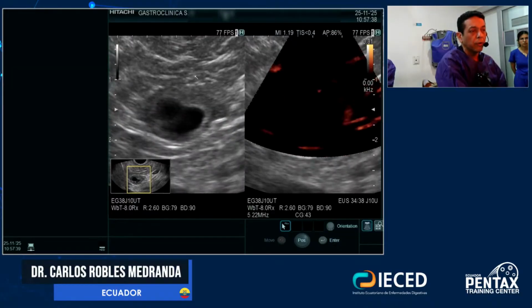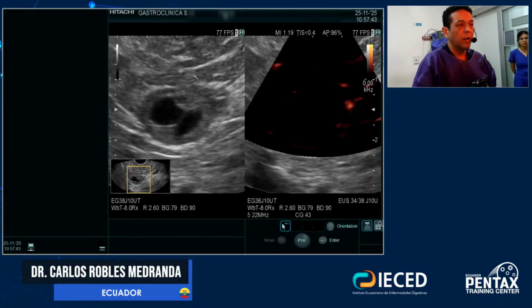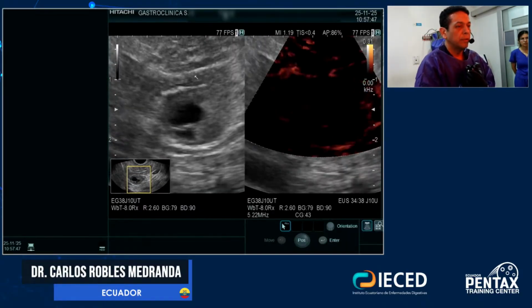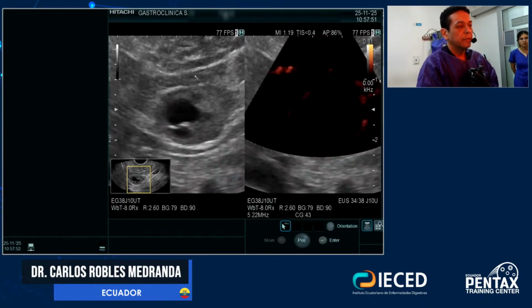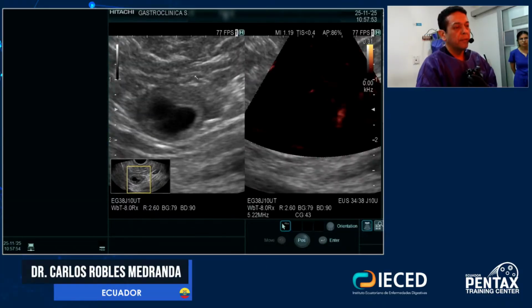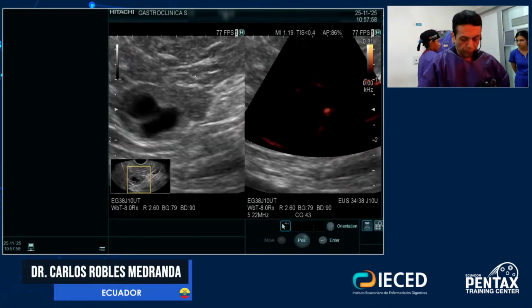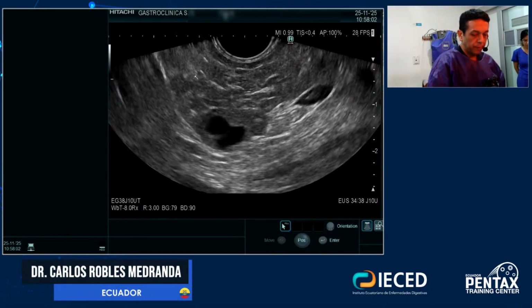So I will try to make a confocal right now, and then I will pass just the needle, because it is difficult to have a very good biopsy from this area with the Murray because of the space that we have. It's like when you have one shot. That's all. So we will use confocal. Well, I need to use contrast first.